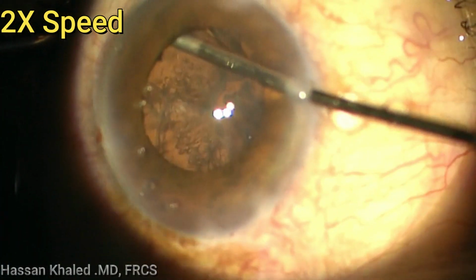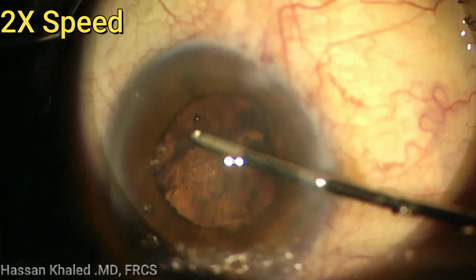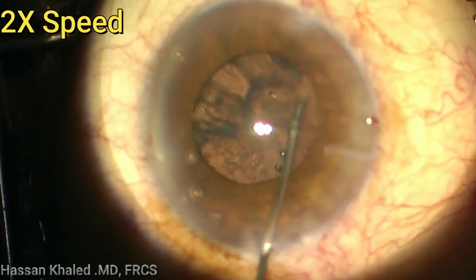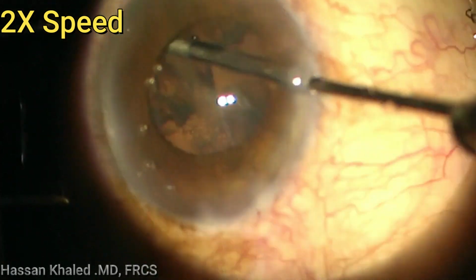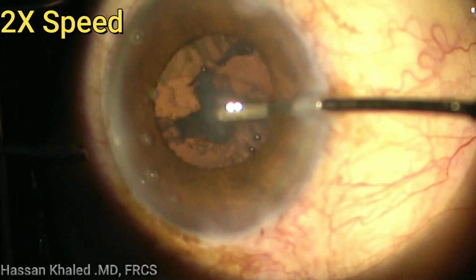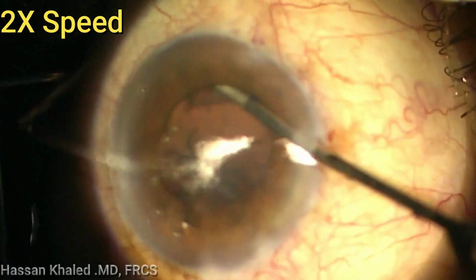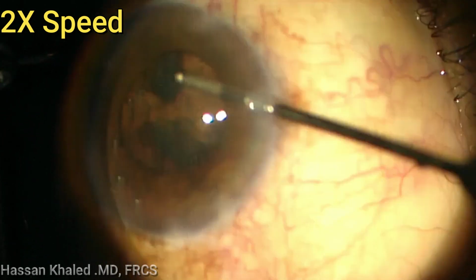Now I'm going to remove this cortex using the aspiration probe, using the dry cortical removal technique without inserting the irrigation inside the anterior chamber to prevent any turbulence inside the anterior chamber. You can see after removing the cortex, I inject dispersive to prevent the prolapsing of the vitreous into the anterior chamber.